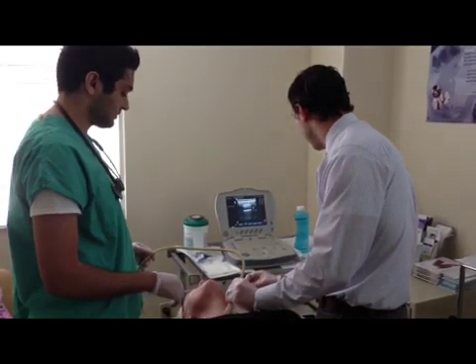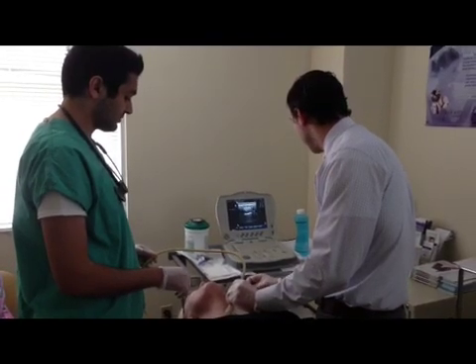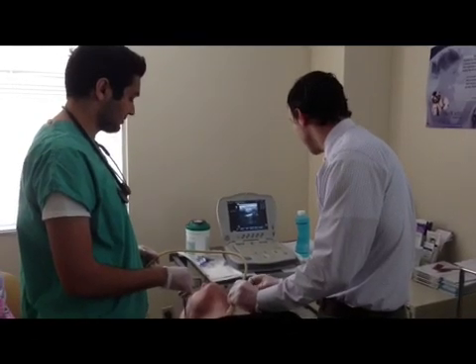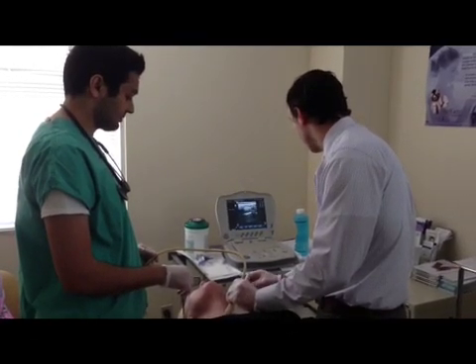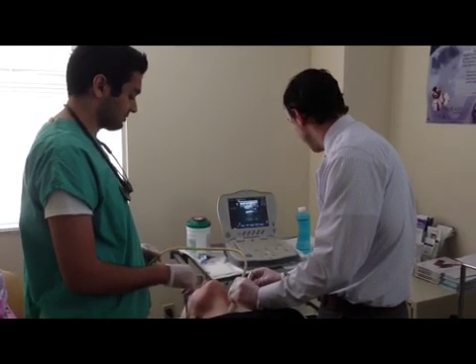We're currently in the nodule and we're drawing fluid — we're drawing cells from it. Technically this is not a biopsy, this is actually a fine needle aspiration. We're not actually obtaining full tissue; we're just obtaining cells for analysis.